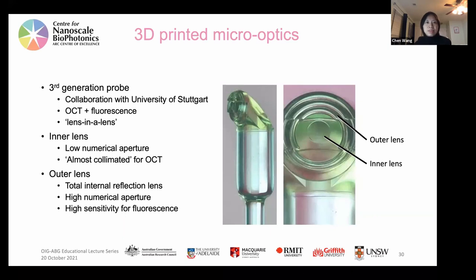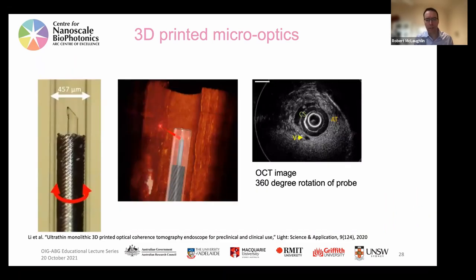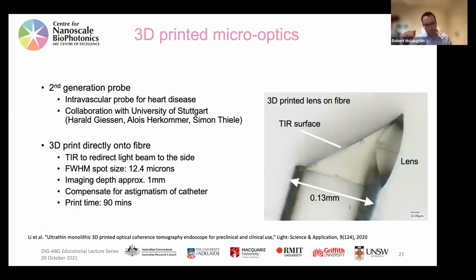Any questions? Yep. So Robert, the surface looks very smooth. Do you need to do any actual processing to make the surface smooth on top of the two-photon polymerization? You can do a little bit of processing afterwards. With these ones, I don't think we did. And with the previous ones that we had, we didn't have to do any processing. I think the layer thickness was something like 100 nanometers. And there's a little bit of smoothing that happens automatically when you print, as things adhere together. But we didn't have to do any processing on these ones, and we didn't find that there were any optical defects from that.